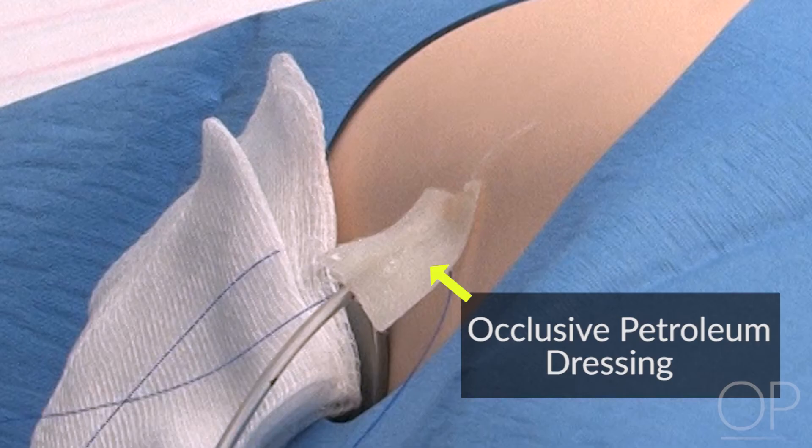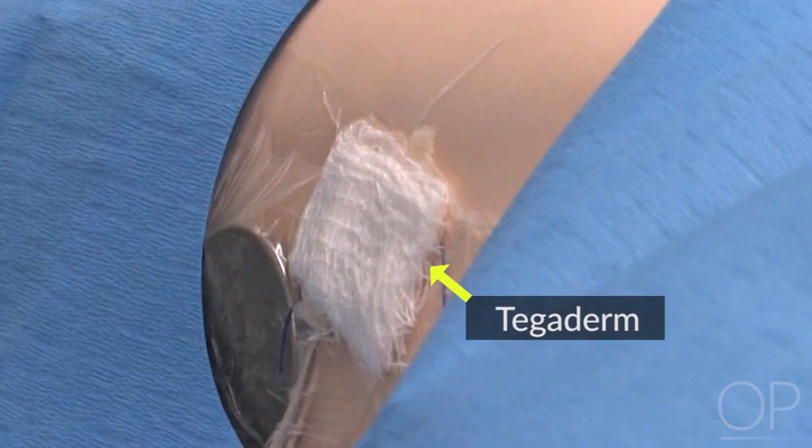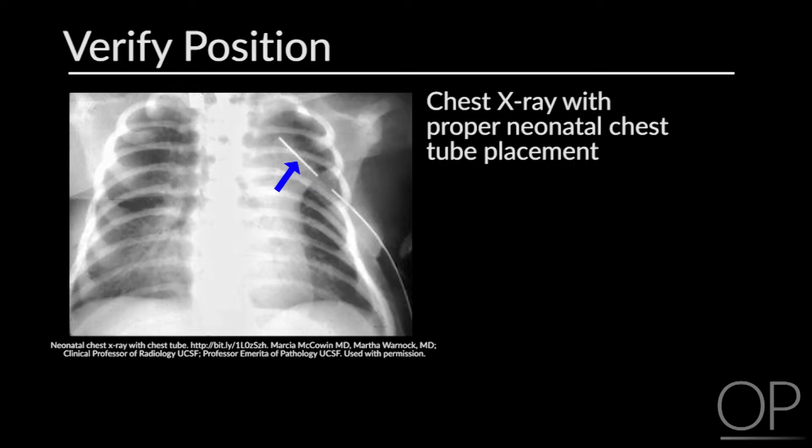Apply occlusive petroleum dressing at the level of the skin. Cover with a small amount of dry gauze. Secure with Tegaderm. Obtain a chest X-ray to verify position.